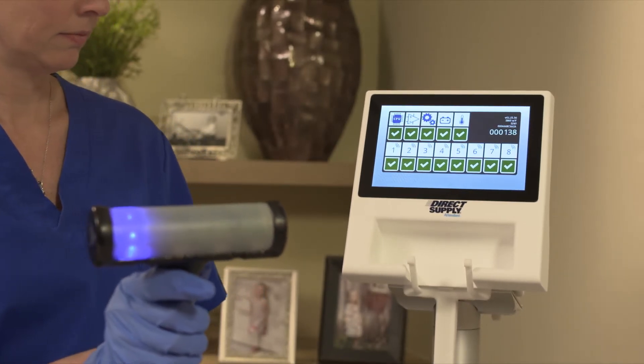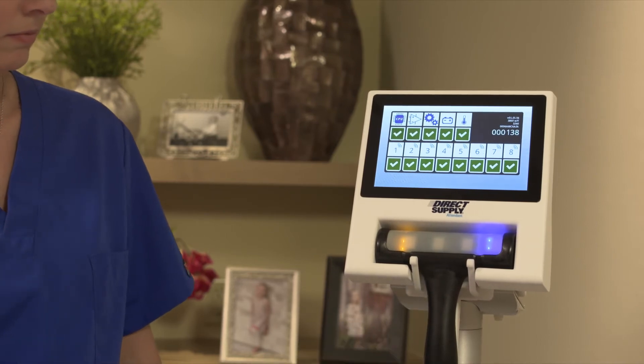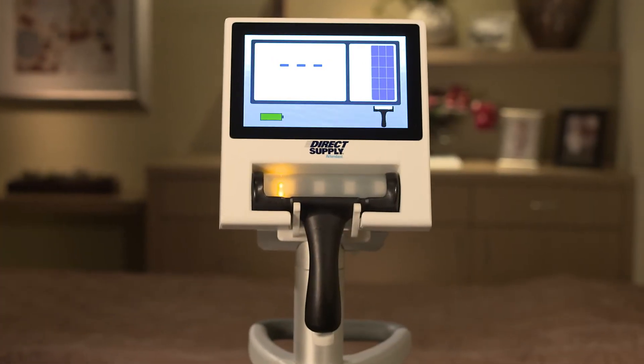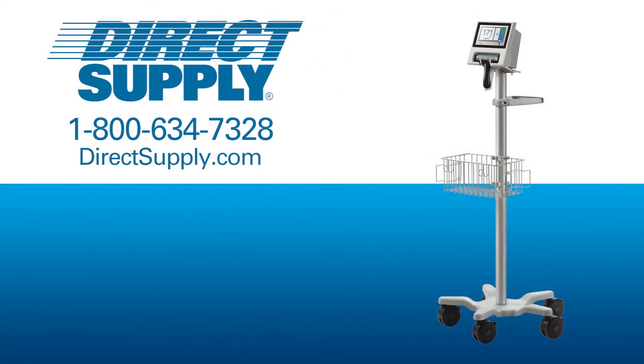To clear the self-diagnostic data, return the scanner probe to its cradle location on the console and it will reset. For more information on this next-generation bladder scanner from Direct Supply, contact your account manager.